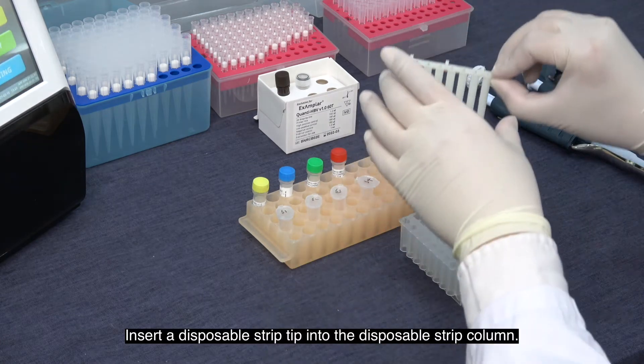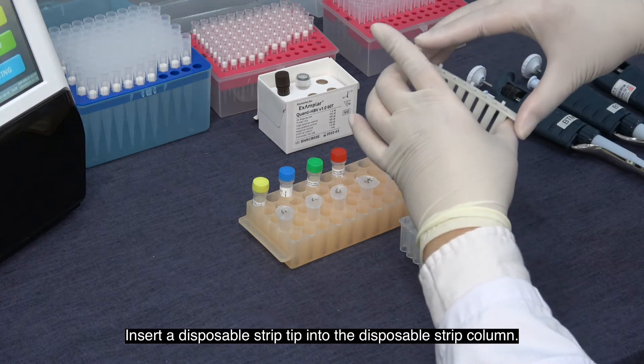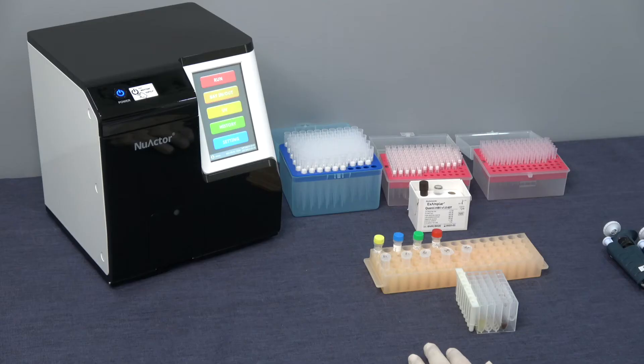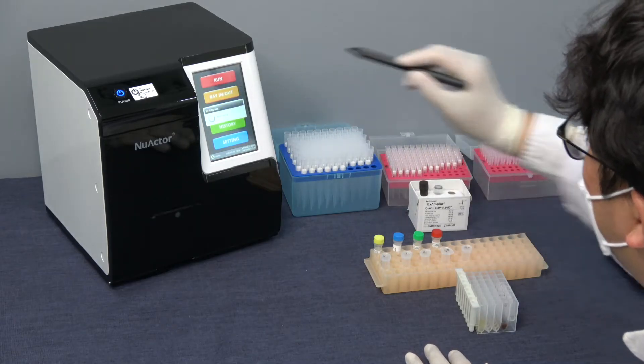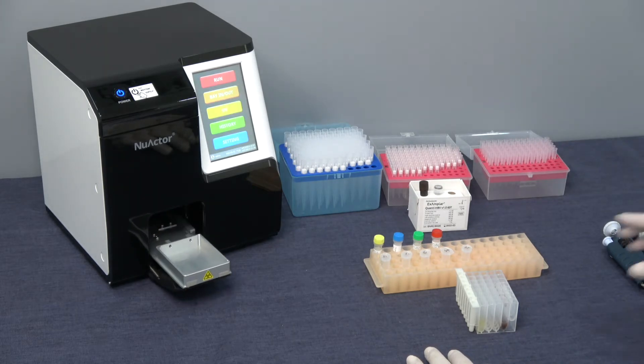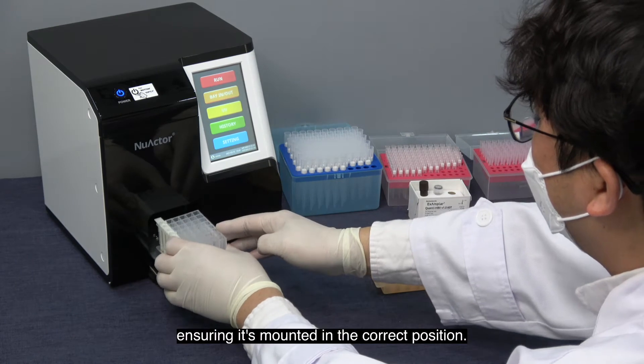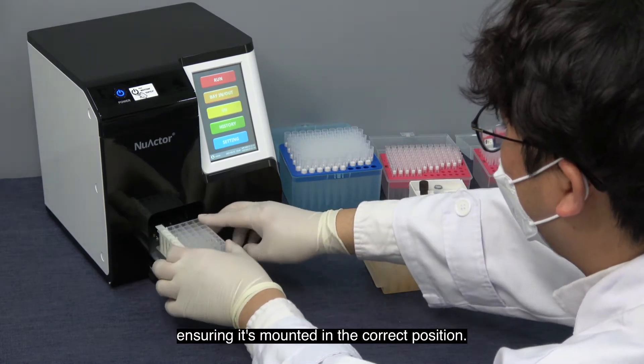Insert a disposable strip tip into the disposable strip column. Load the cartridge onto the extractor's cartridge bay ensuring it's mounted in the correct position.